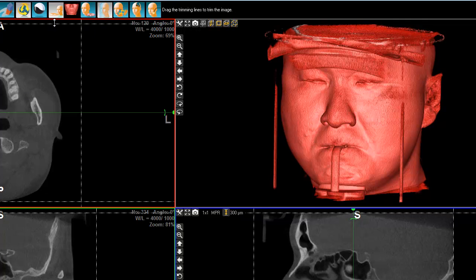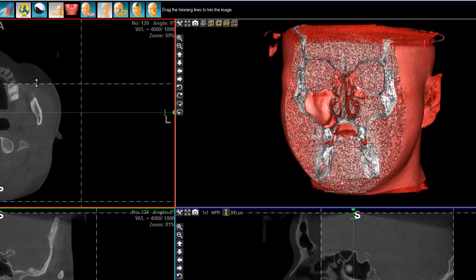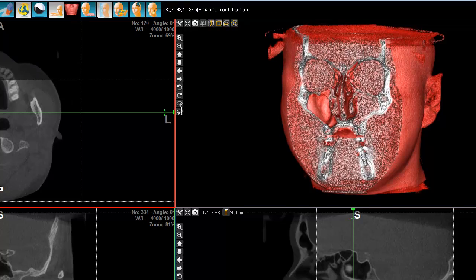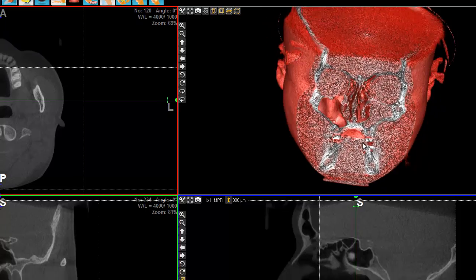I use the Trim function, which enables me to see inside the Sinus.